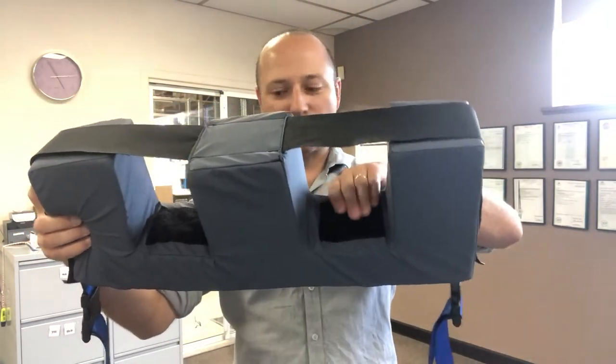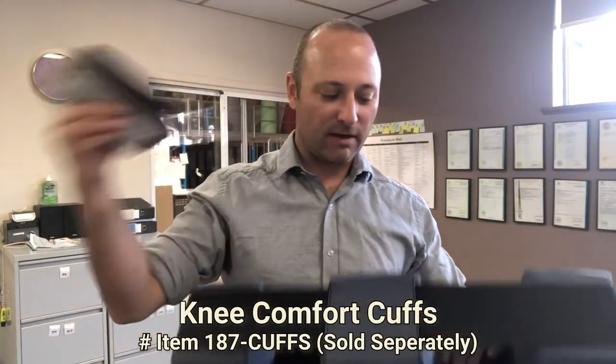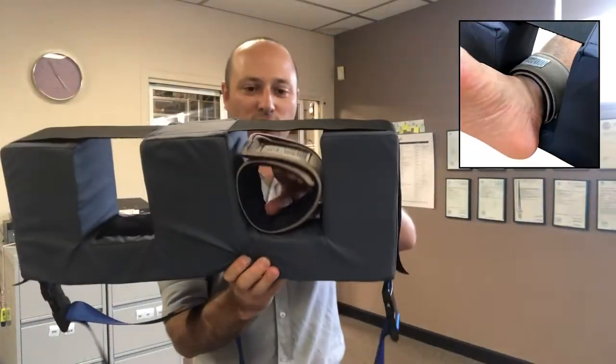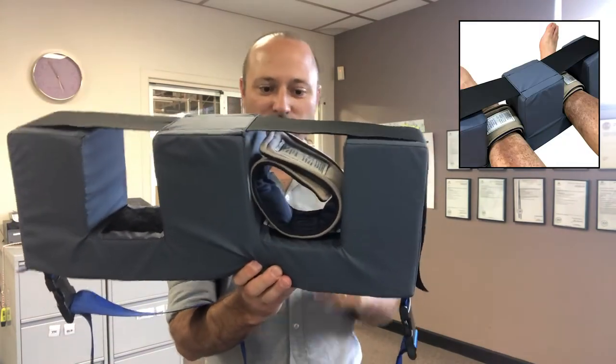Inside here there's a velcro part there and there, and that's to hold one of our knee comfort cuffs. They'll just velcro into position, and then you can also velcro up the top here to adjust the size for the legs.